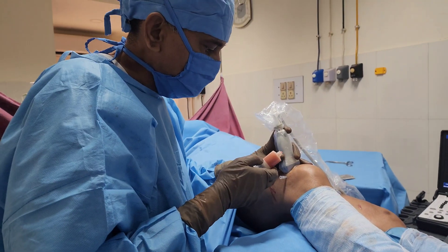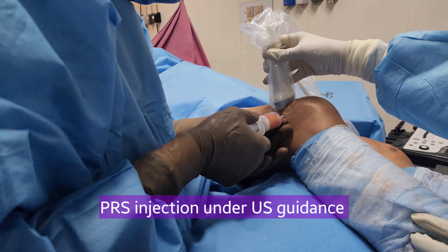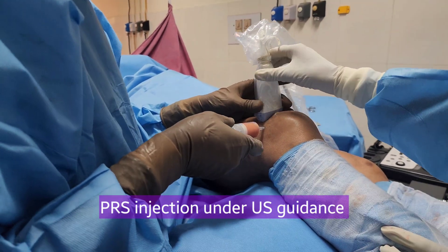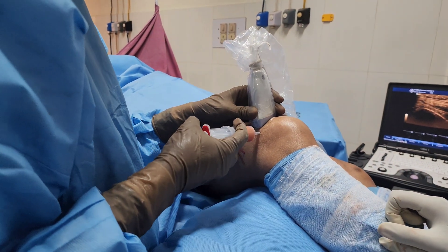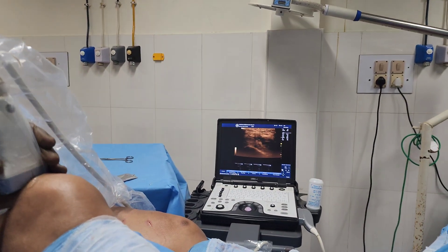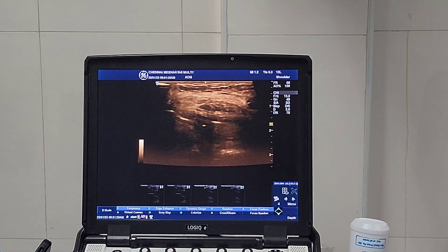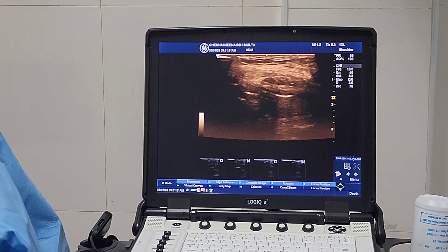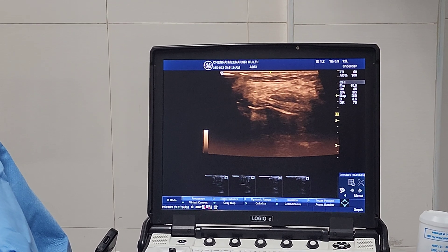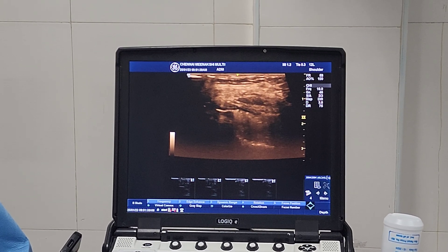Under ultrasound guidance, the needle is already there in the joint. I am connecting this SVF syringe to the needle and making it tight. The probe and needle are in place. I am injecting the SVF. You can see the joint distending with the SVF.